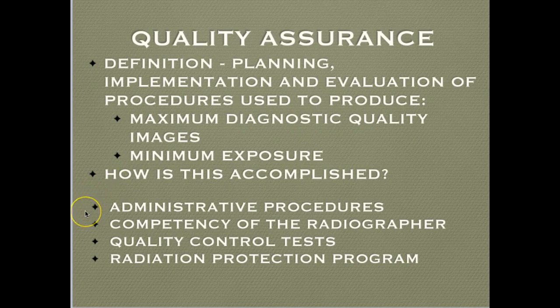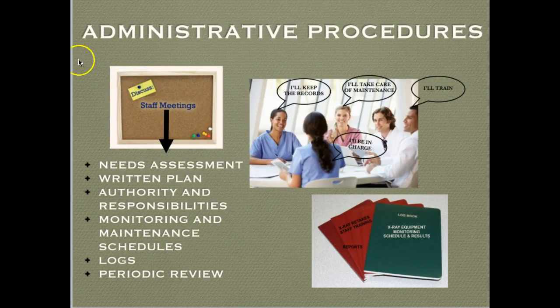We can accomplish this by administrative procedures, certainly the competency of the radiographer, quality control tests for our equipment and armamentarium, and a radiation protection program. Let's look at administrative procedures.